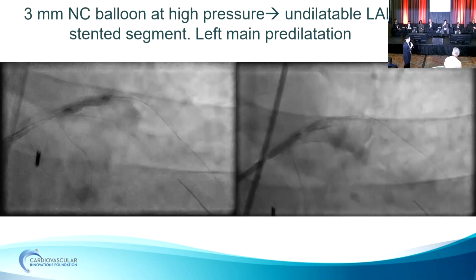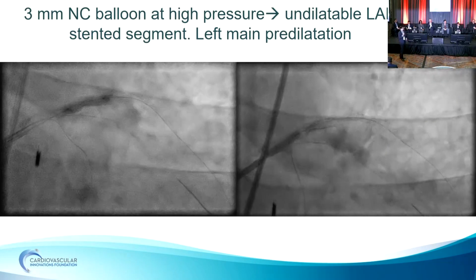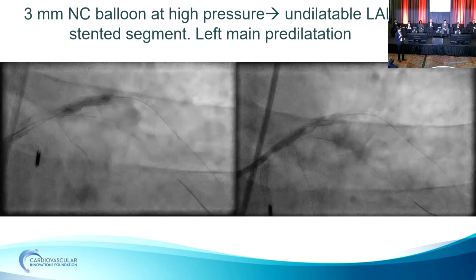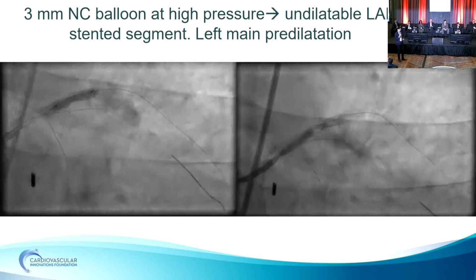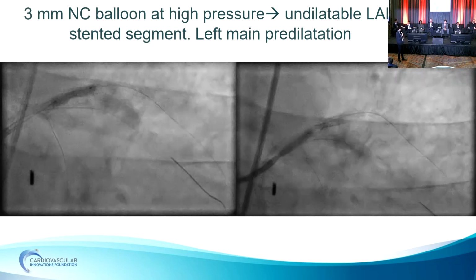You mean if there's perforation, we can do a ping pong technique. Great points. So we decided to do initially a 3 millimeter balloon at high pressure. It did not expand. And during the procedure, of course, there was intermittent ventricularization of pressure, patient having chest pain.